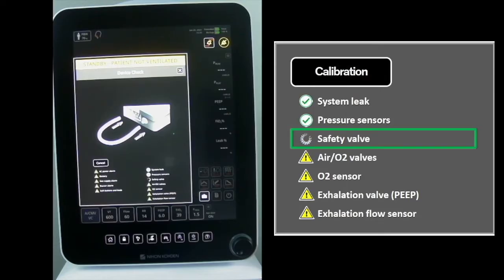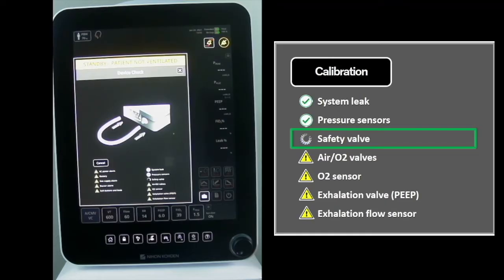In the second stage, with the exhalation valve closed, inspiratory flow will pass through the safety valve to ensure minimal resistance.